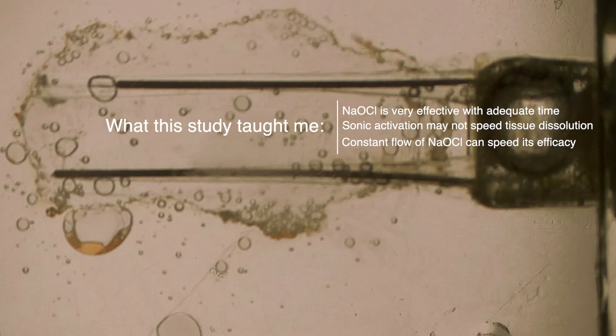Great for stirring things up, obviously, and then irrigating them out. We do need to rattle things around in there a little bit. But it's not going to shorten the time to digest all the pulp.